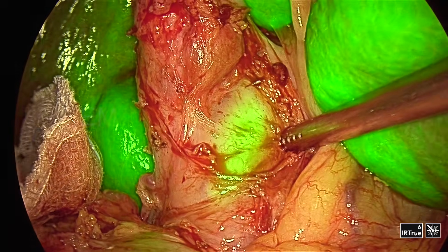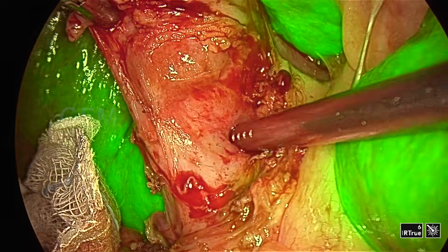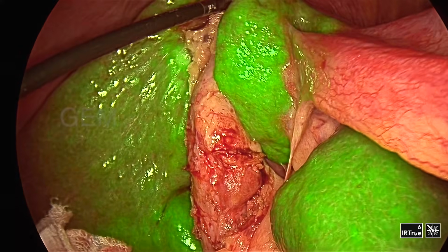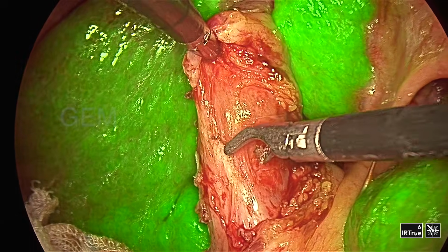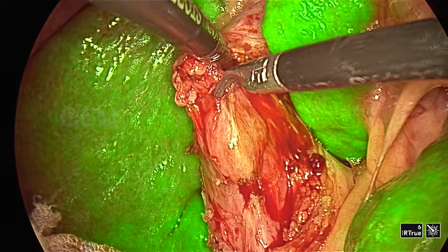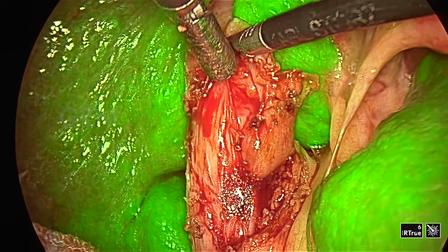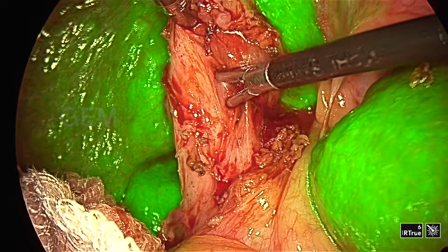So now you can see the CBD very clearly. That is the infundibulocystic junction, and you can see the node there. Just below the node, the artery will be there. In this case, it is really the IR mode, the ICG mode, that is helping me to do this case, and you will appreciate that when you are watching the video. So I'm now taking the node and dissecting the artery. I'm dissecting the cystic artery.